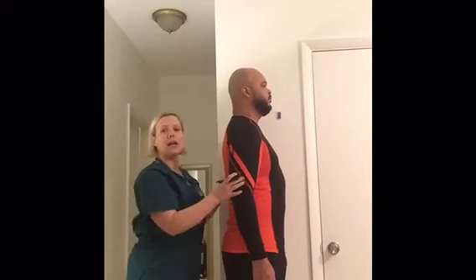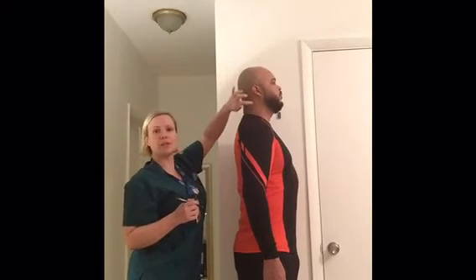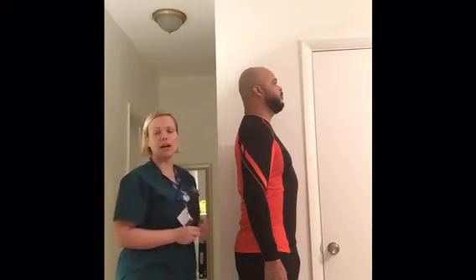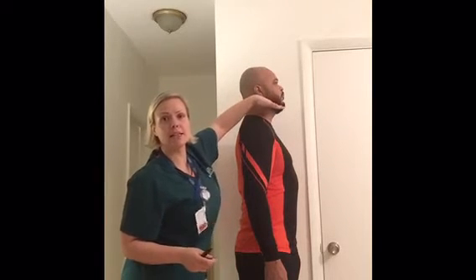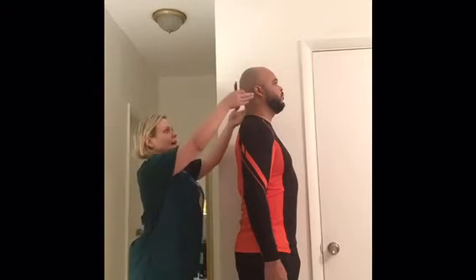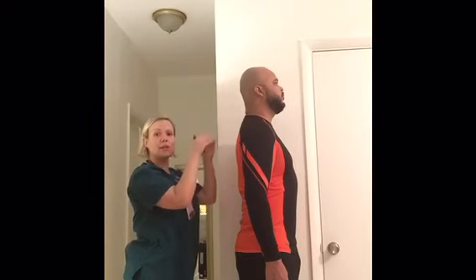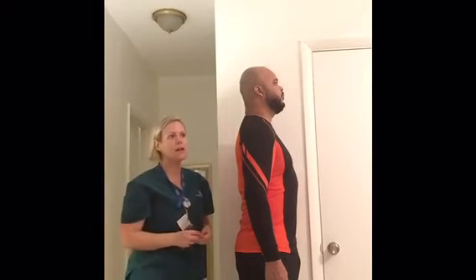Then I will do my lateral, so I'm going to ask the patient to please turn around facing the window, to your left, so your left shoulder will be centered at the middle, and do a little step forward. Right there. I need to make sure that the cervical is right at the center of the IR. We want to make sure that the chin is straight and accurate, like both sides of the head. That way you have a superimposition of everything to make sure it's a true lateral.